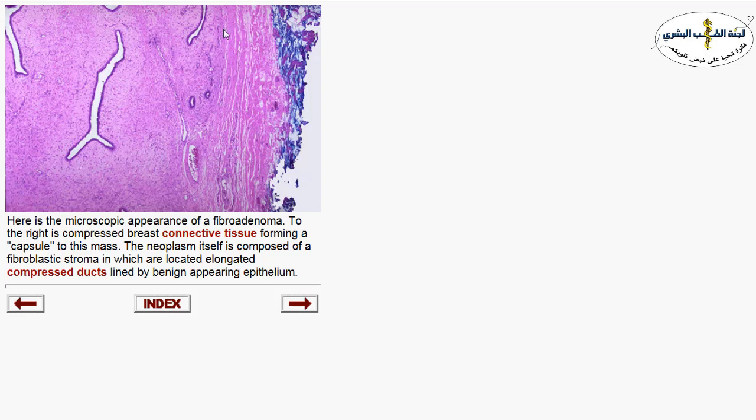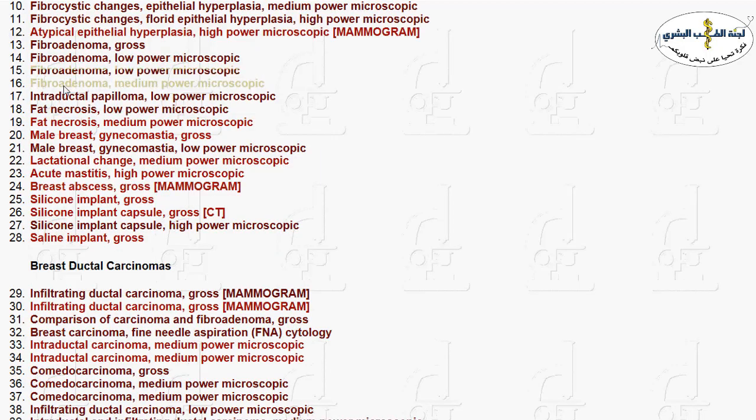Fibroadenoma is another lesion affecting young females in their teens, 20s, and 30s. It is a biphasic tumor with proliferation of both the glandular and stromal component — but benign proliferation — forming a well-defined mass lesion. The glands could be compressed or open within the fibroadenoma. Here you can see the fibrous stroma and glandular proliferation with compressed glands.